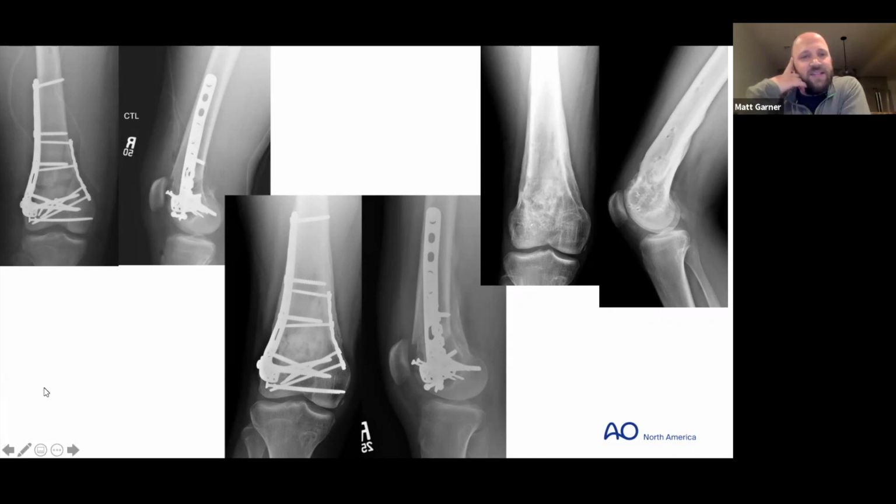I mean, that 7 centimeters or 9 centimeters comes from knee literature. So I think it's important to pay attention to that. If you talk to your microvascular surgeons and your plastic surgeons, far more important than the distance between the incisions is the overlap of the incisions. It's really hard not to have a lot of overlap in the distal femur, so these incisions tend to overlap quite a bit. So I do try to keep it at 7 centimeters.